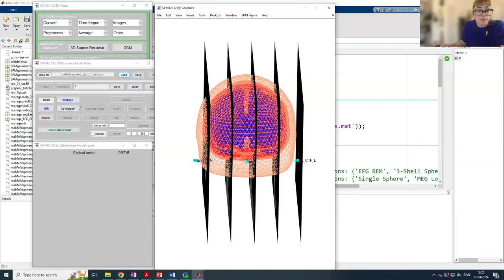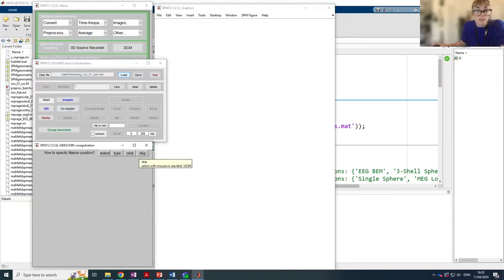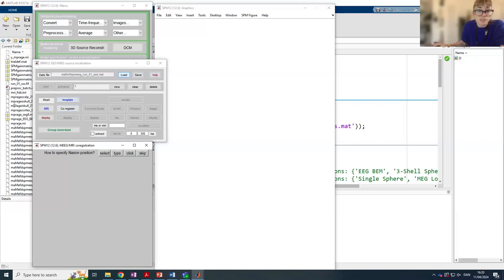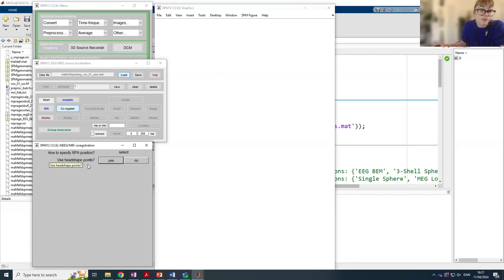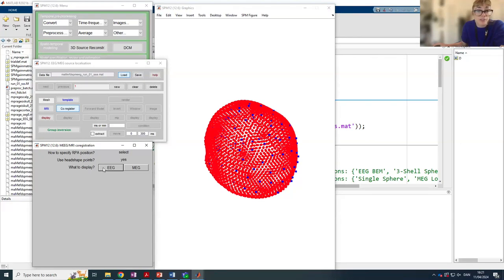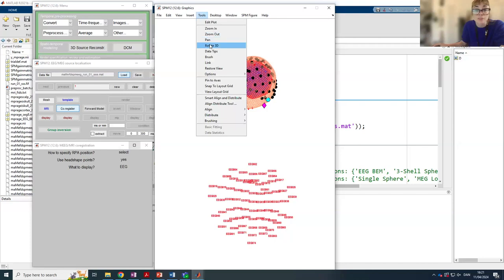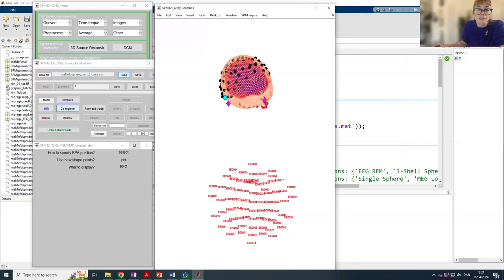In the graphics window we have an image of our mesh. The co-register button is now enabled. We need to specify the positions of our fiducials — typically the nasion, right preauricular point, and left preauricular point. These positions can be specified by typing them in, clicking on a structural image, or selecting from a list if fiducials are saved with our dataset. We do have them saved, so we select from a list. We're also asked if we want to use head shape points collected with the Polhemus digitizer, which helps with co-registration — so we say yes. We can inspect the EEG co-registration results, checking that the electrodes (black spheres) are roughly on the scalp — this looks fine.